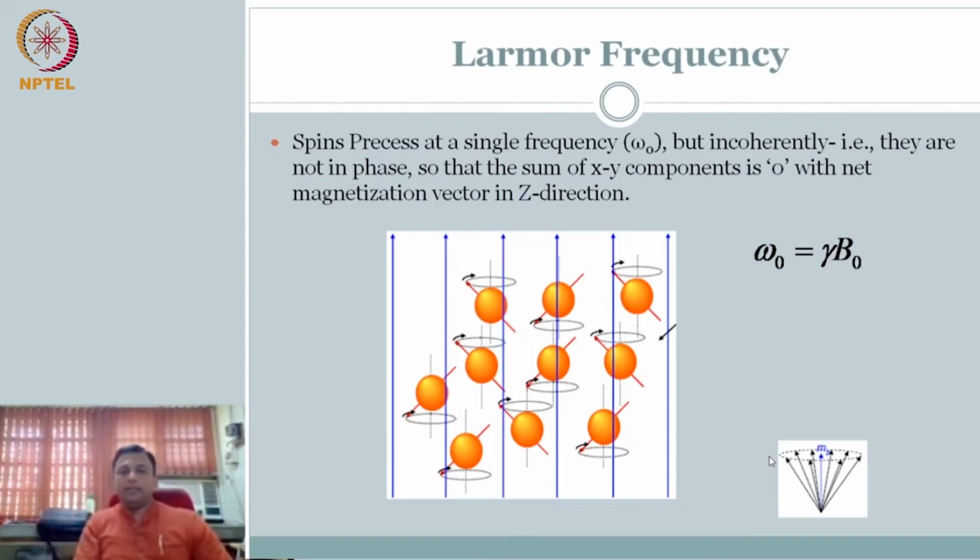So let's put some images to explain. So this is what it is. The blue arrow that you see is the external magnetic field, right? Each one is spinning at a different orientation. When you apply the external magnetic field, they all try to align, and you can relate this to the different hands where each would have stopped. They are spinning around, and there is an Mz.